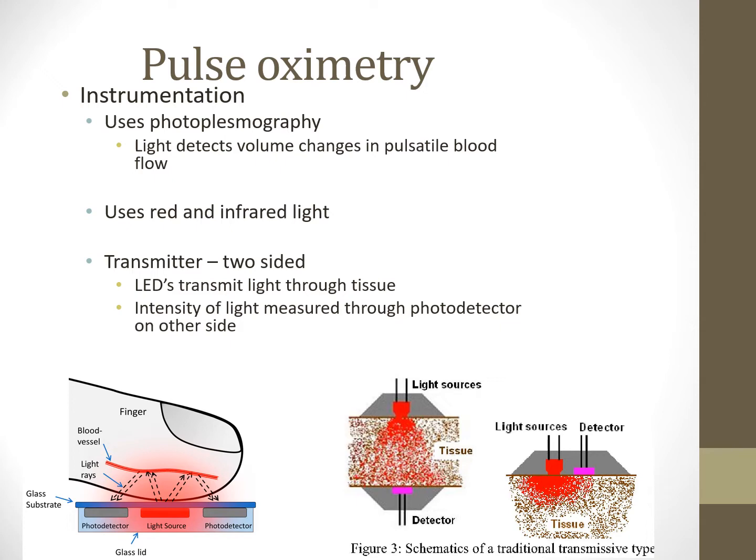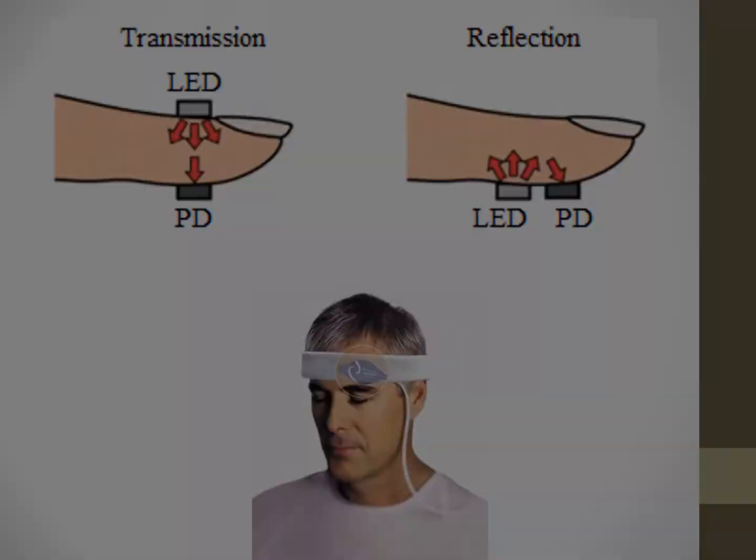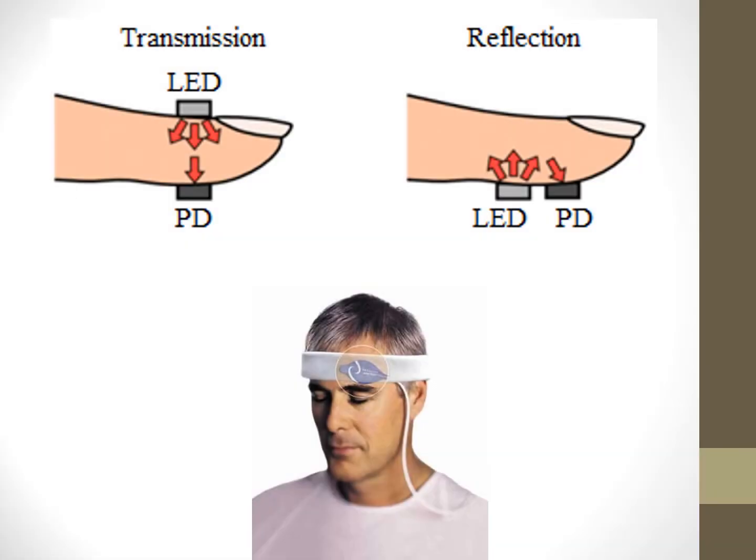But there are also other sources, and that's what I have a picture of on this next page. There's reflective pulse oximetry. Reflective pulse oximetry says, hey, you have very, very poor perfusion. I know there's a finger here in this top graph, but look at this bottom graph of this person here. He looks like he's a villain from some sort of thing, like Magneto, which he wasn't. But anyway, we're moving on here.